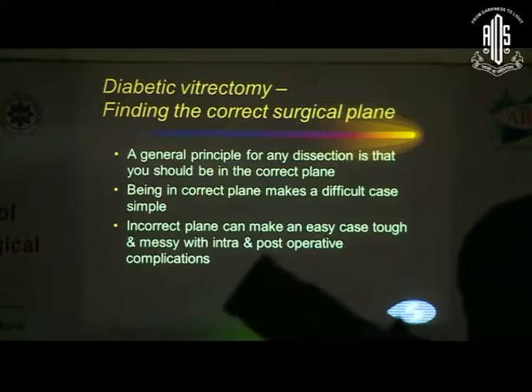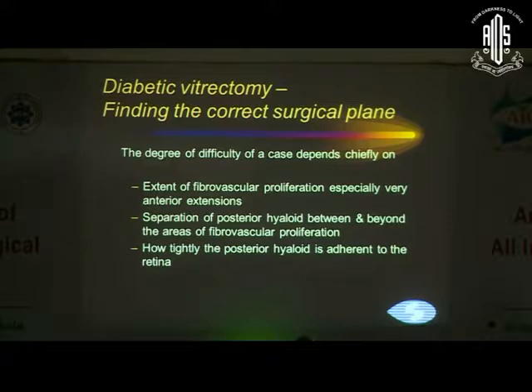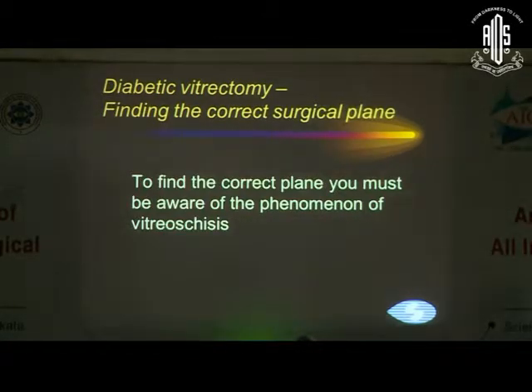A general principle for any dissection is that you should be in the correct plane. Being in the correct plane makes a difficult case simple, and conversely, being in the incorrect plane can make an easy case tough and messy with intra and post-operative complications. And the degree of difficulty depends on the extent of the fibrovascular proliferations, the separation of the posterior hyaloid between and beyond the areas, as we'll see later, and how tightly it is adherent.